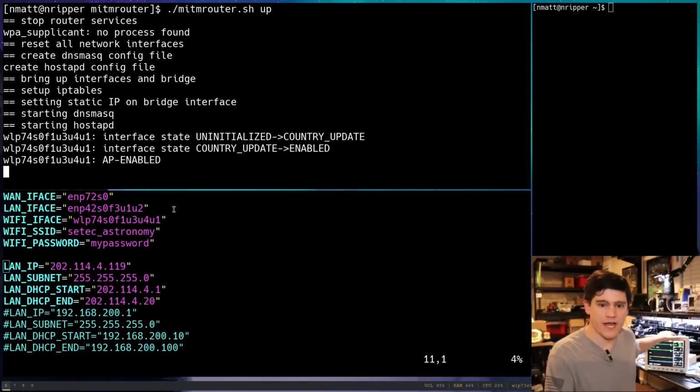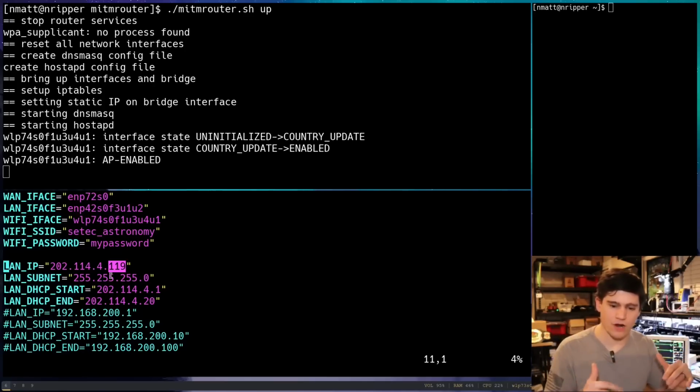So this device has a hard-coded IP address of 202.114.4.115. And the server that it attempts to reach out to is .119. What we want to do is set up a situation where this box thinks that it's on the same subnet, the same layer 2 network, as our Linux machine here.